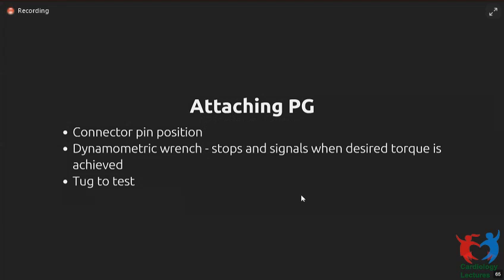Now, once this is done, you push the lead into the device, and maybe I could have had a picture here. So if you know the picture, you have the connector blocks when you push the lead in, and beyond the connector block, there's a last part of the tunnel into which the lead goes, which will be clear. You can see that. Now, as you push in the pin, you should see that the pin comes into that tunnel. Okay? So if it doesn't come all the way there and you just fix it, it might be loose. You'll end up with set screw issues. So always see that you see the metallic part of the lead come into that distal part of the port, and then only fix it.